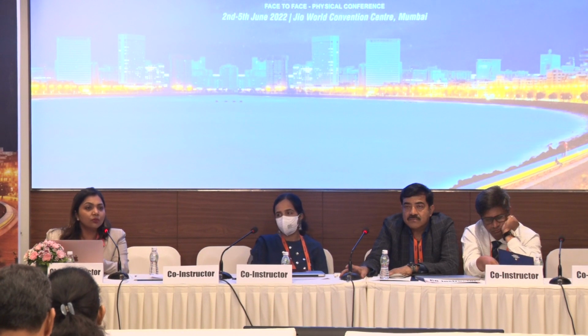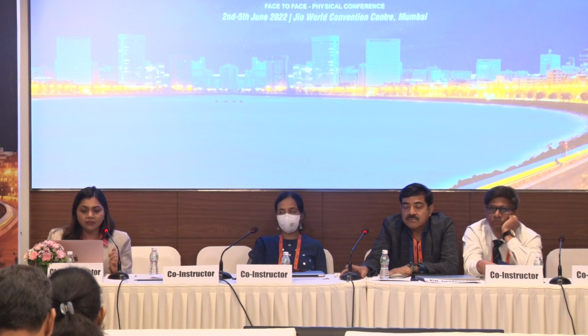Thank you, Dr. Bhargav. That was excellently covered. So we have multiple take-home points here. First, treat any dry eye and ask the patient to come back, and when the dry eye has been treated, then go for multiple readings if there is an inconsistency. And even if on repeat testing the inconsistency stays, then do integrate your K readings on the various software present online, free of cost. So do not hesitate to do that. That was indeed very wonderfully covered.